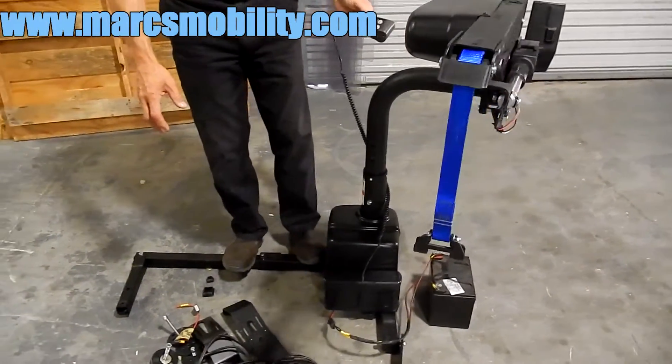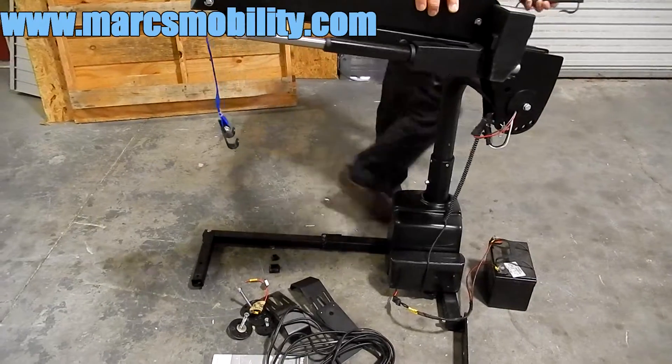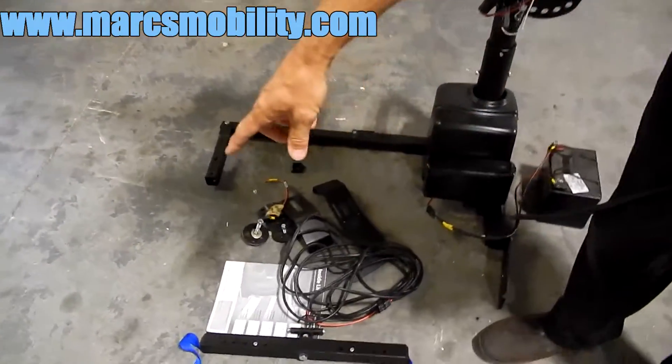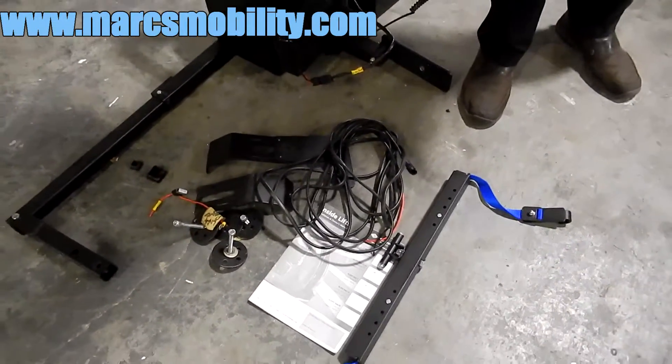This lift has a 400-pound weight capability. It was only used for six months — it's literally brand new. It comes with the electrical harness, the spreader bar, the manual, and the reinforcement plates.